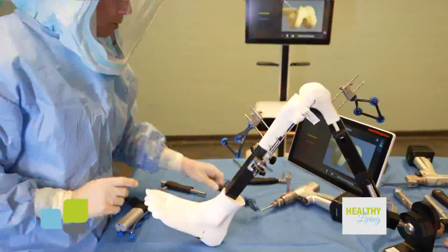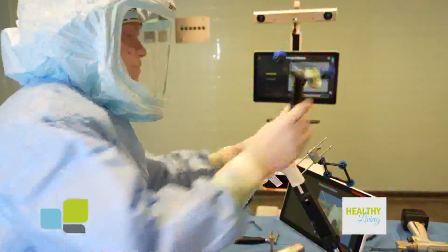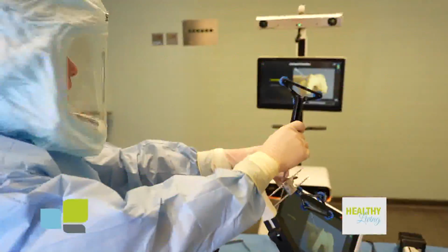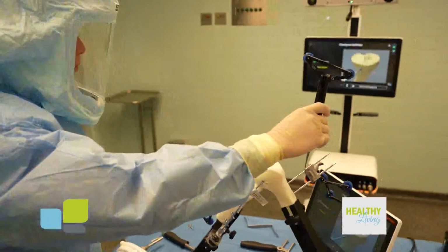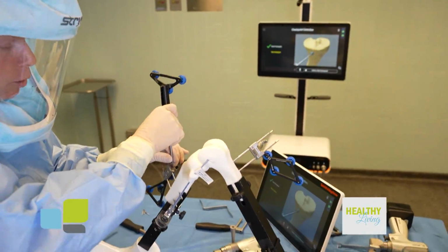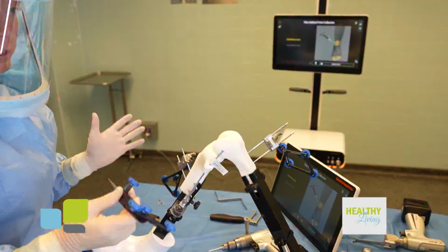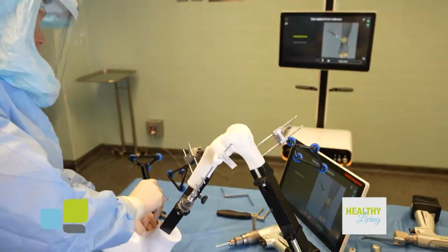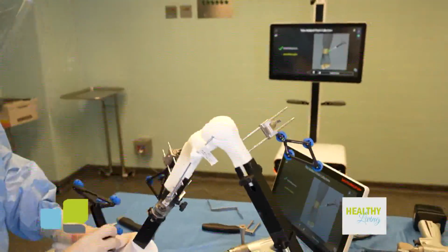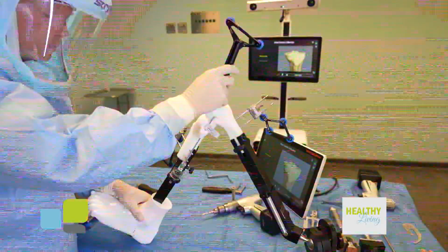Oh, look at this. Okay, wow. I did finger tight. We're good, I think. There we go. Good. All right, so I'm going to give it some key data points. And what does that mean, key data points? So these points that I'm giving the robot now are points to ensure that none of these positioners move during the course of the case. Okay, that makes sense. To make sure that it stays precisely aligned. Oh, wow. Look at this. Okay, now we're giving it the knee center.